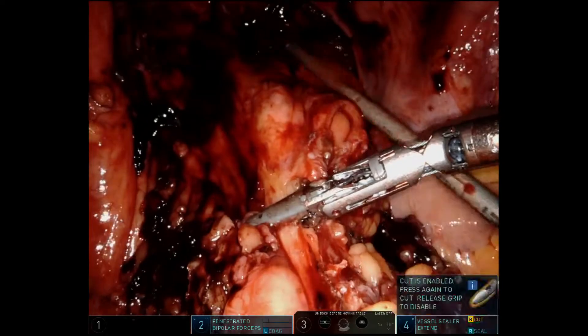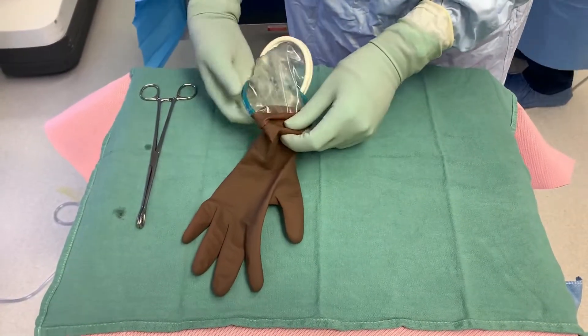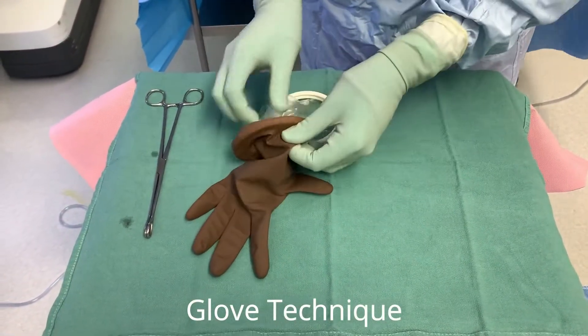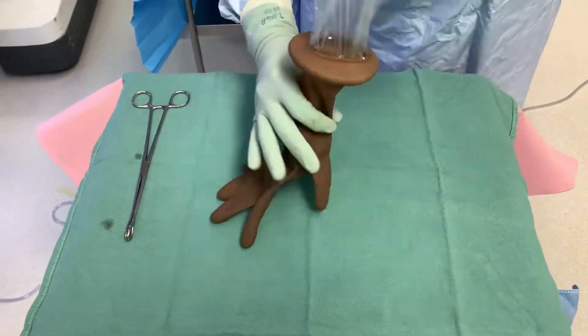We are now getting ready to extract the specimen. Here is the glove technique that we use in order to mitigate aerosolization of the pneumoperitoneum into the atmosphere in the operating room.